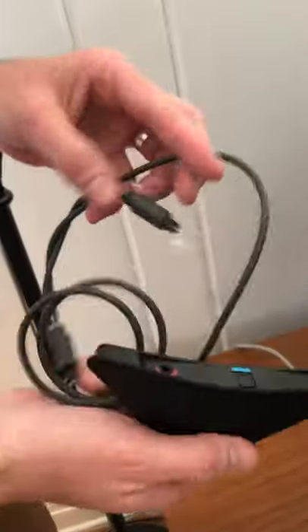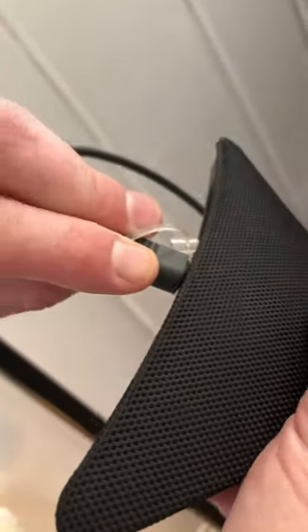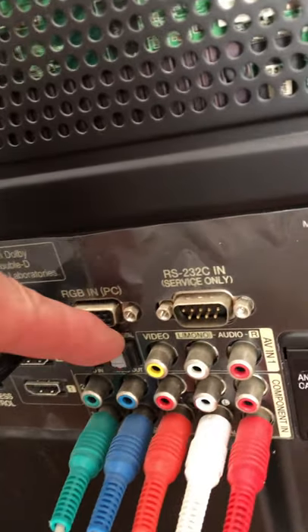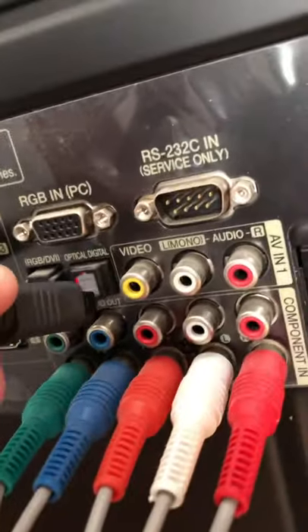The first step is to take the TV Play and the digital audio link and plug that into the bottom of the TV Play, making sure it's oriented correctly. Then you're going to plug that into the back of the television into the digital audio out or optical audio out port, and connect the other portion.